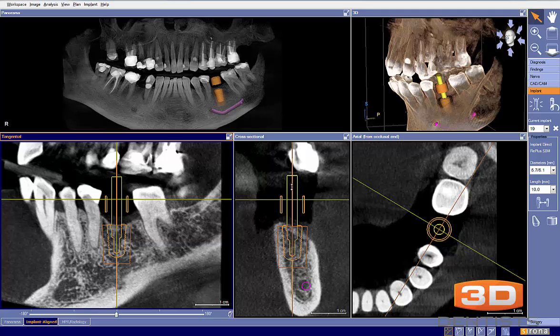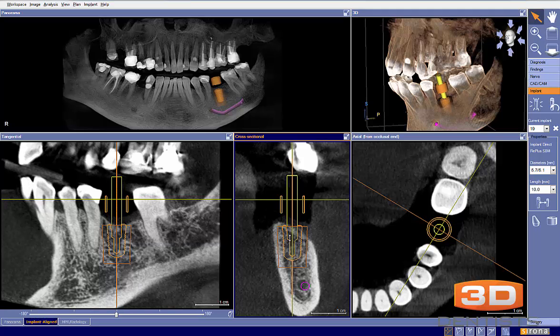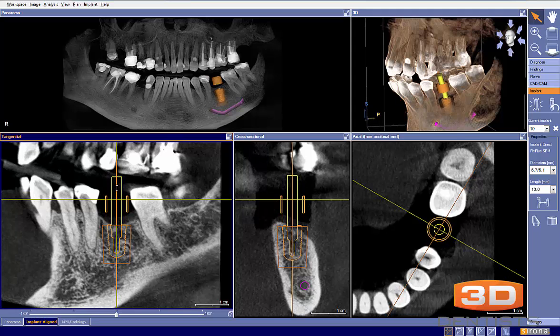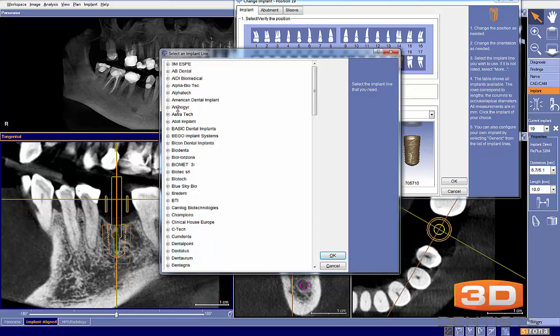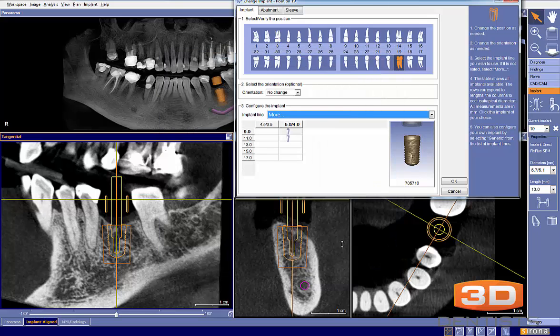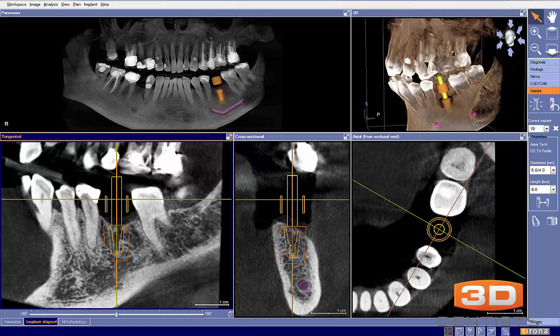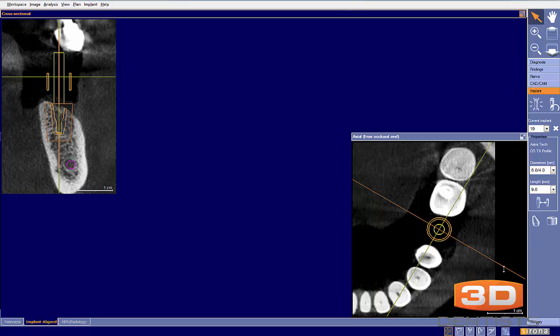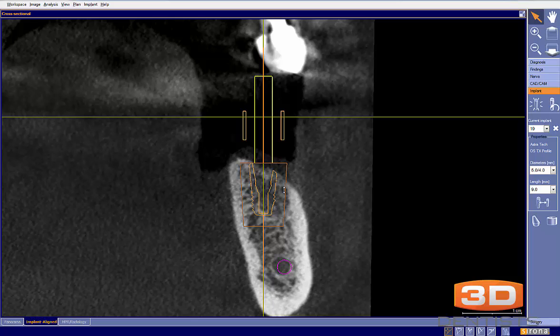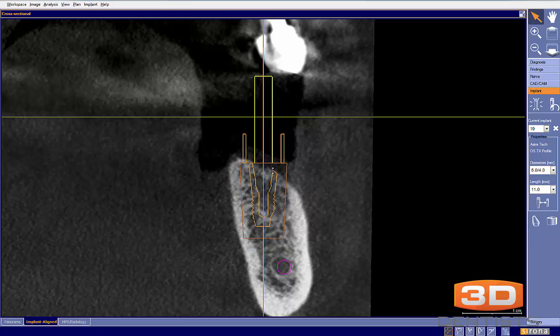I'd like to point out one other option in a case like this, because many colleagues aren't as comfortable doing grafts. That option would be from Astra — they have their Profile implant, which is a sloped implant. With this sloped design, we can actually avoid doing any grafting in this particular case. That certainly is a choice, though it requires having the implant, the surgical kit, and the proper timing and rotation for correct placement. We could go to the 11mm, or even possibly the 13mm — though I think 11mm would be plenty here. That option exists.